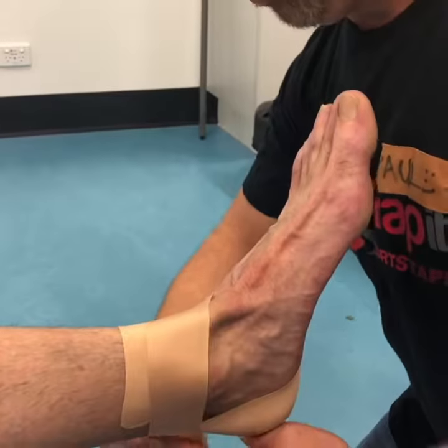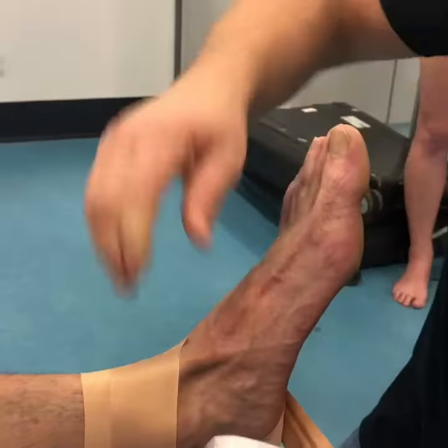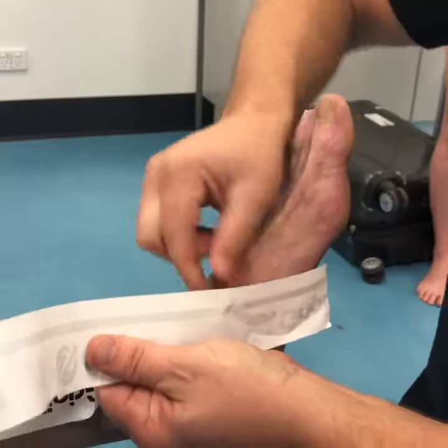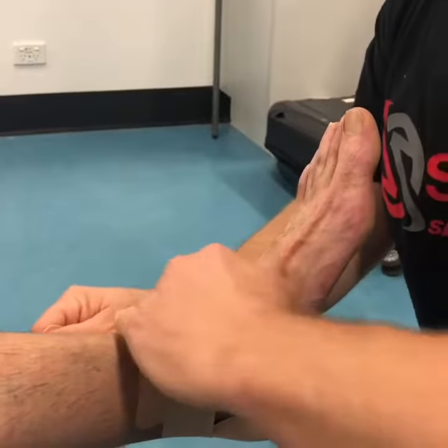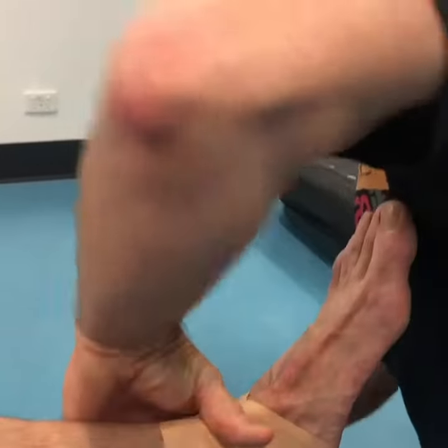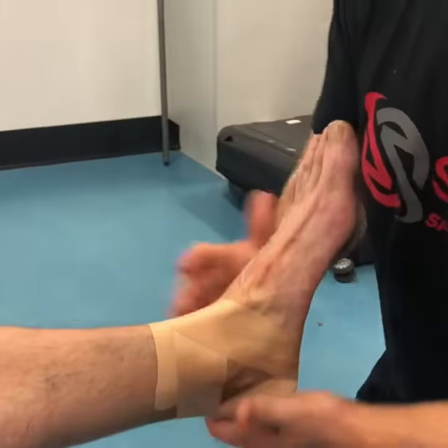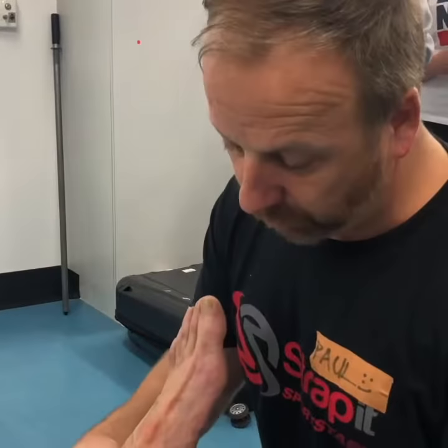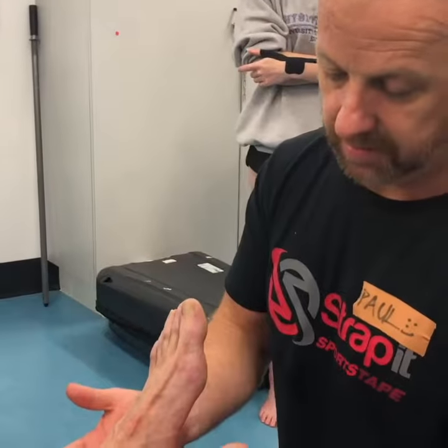We're just hooking around as per a normal figure of eight. This can go over the top of rigid tape and over the top of active kinesiology — whatever tool you're using based on the pathology in front of you. So you effectively do a figure eight, compress it in, lock it up. That's a nice technique for stability, compressive support, and control of the ankle — not full control, partial control — supporting tendons.